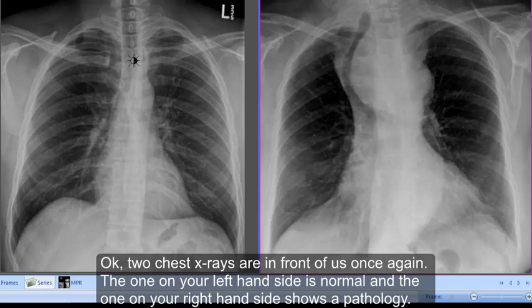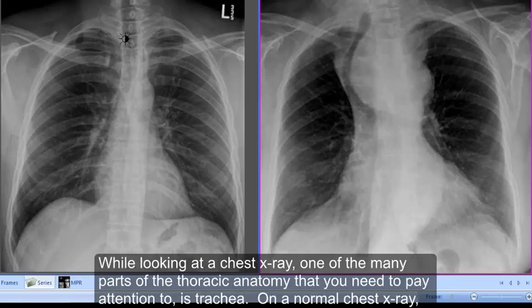Two chest x-rays are in front of us. The one on your left hand side is normal, and the one on your right hand side shows a pathology. While looking at a chest x-ray, one of the many parts of the thoracic anatomy that you need to pay attention to is the trachea.